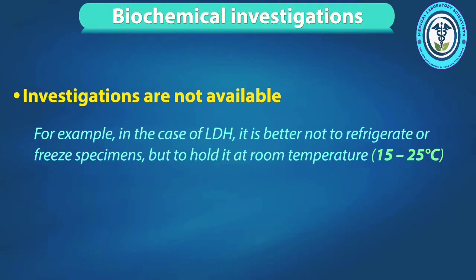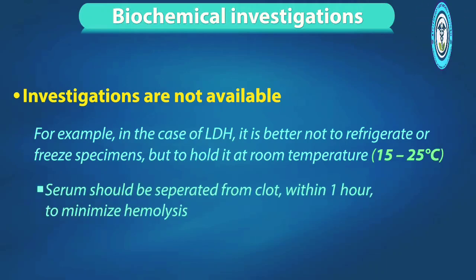For example, in the case of LDH, it is better not to refrigerate or freeze the specimen, but to hold it at room temperature at 15 to 25 degrees centigrade. Serum should be separated from the clot within 1 hour to minimize hemolysis.